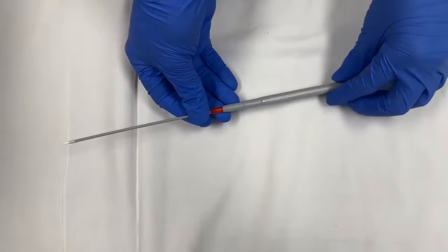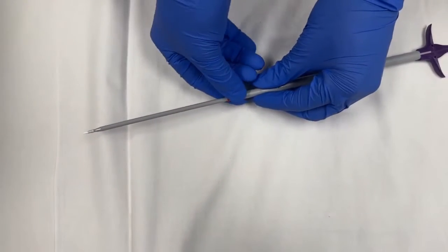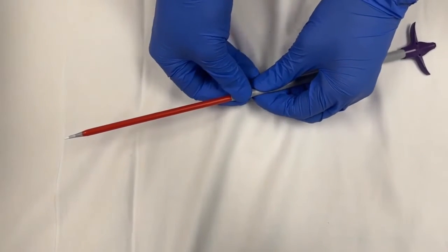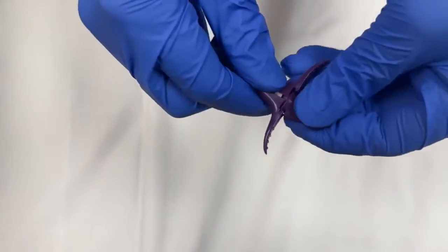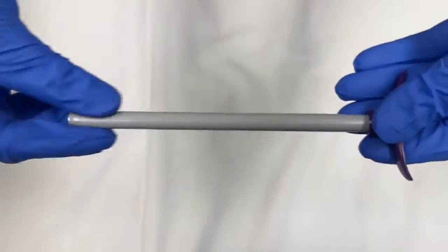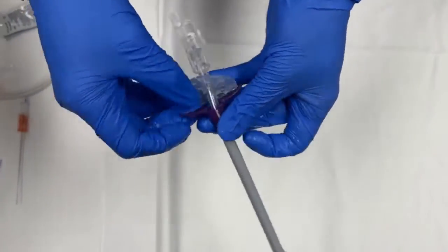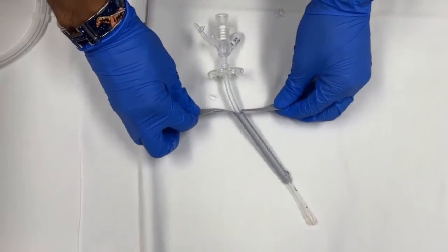Before we see insertion of the serial dilator into the patient, we will see how the serial dilator looks and how it works. It basically consists of five dilators with a progressively increasing diameter, and the third one is colored red. After we insert the fifth and last dilator, we remove the smaller dilators from inside, and then insert the tube into the widest dilator into the patient's stomach. Then we peel away the dilators to remove them from the patient.